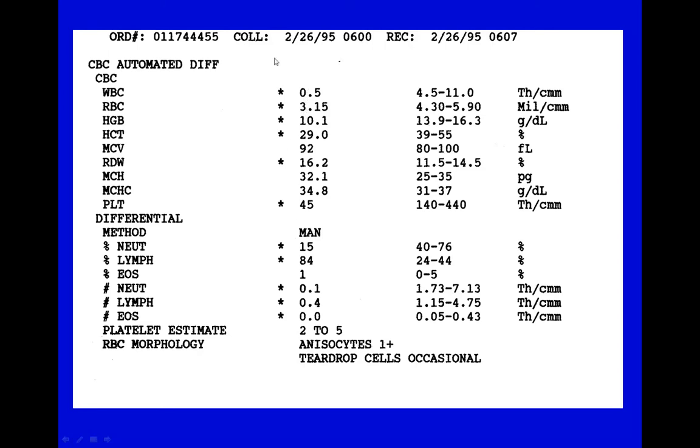So what's wrong with this patient? This is the typical kind of sample that you'll see on a patient who's receiving chemotherapy or radiation therapy for cancer treatment. Somebody that's having a bone marrow transplant, or we're killing their bone marrow so that they can get ready to have a bone marrow transplant. Could you see why they would have neutropenic precautions on this patient's doorway? So I'd go to this patient's room and it would say neutropenic precautions. They're telling me this person doesn't have a very good ability to fight infection at all. They're going to have them in isolation. They're going to make sure that visitors who come to visit them, that we don't have somebody that's sick.